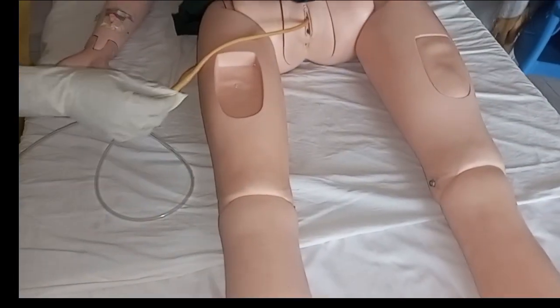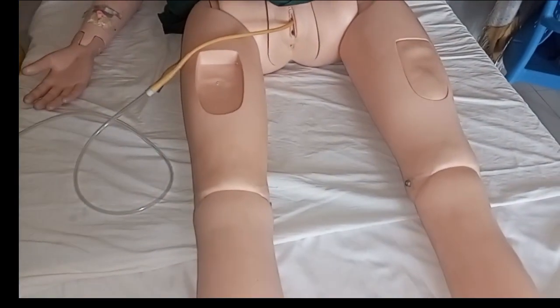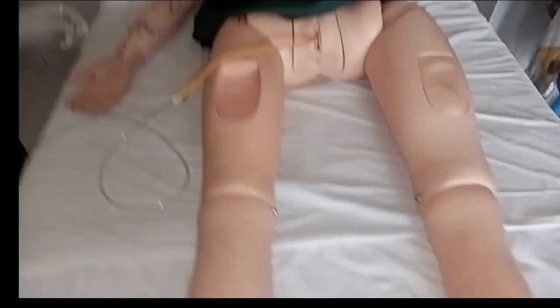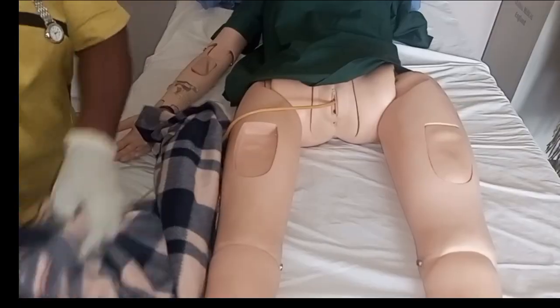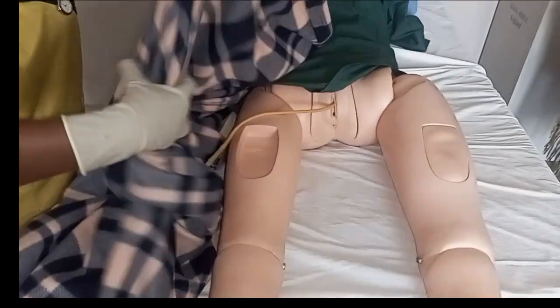Position the urine bag below the patient's level for proper drainage. I am done with the procedure. Make the patient comfortable. The patient did not express any discomfort or pain.